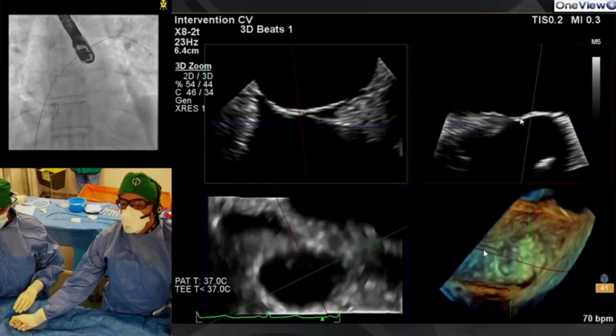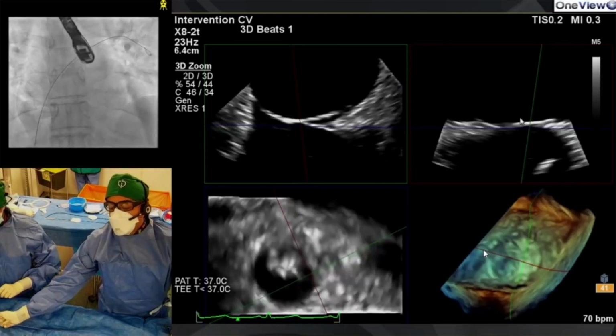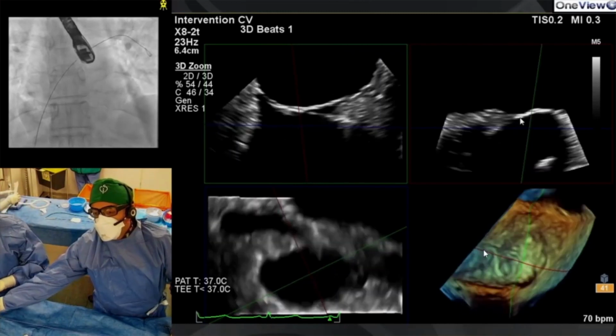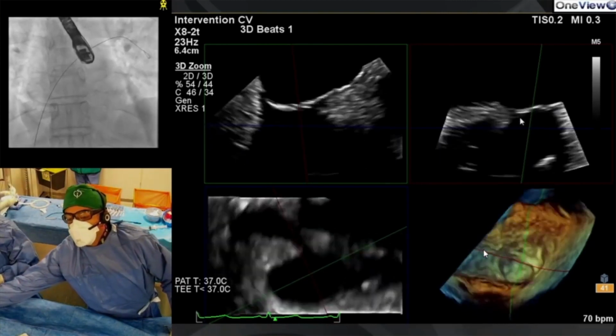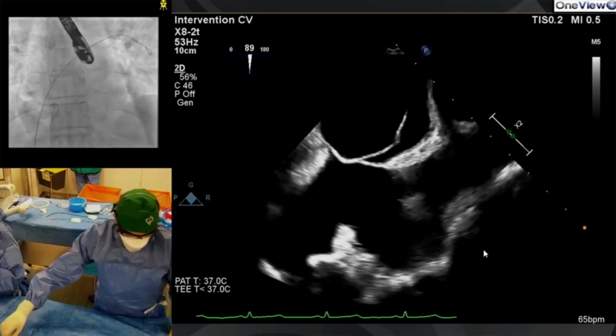3D anatomy like this, and you can see everything. But in this case, I don't actually know how it's going to behave, and I'm worried we've got a small LA opening and then a wide RA opening. We've got an aorta, we've got a ridge, we've got limited space. So in this case, I suspect that we will go for an ASD device because we're going to plug the gap. But it all depends on how the wire behaves, and it also depends on the balloon.